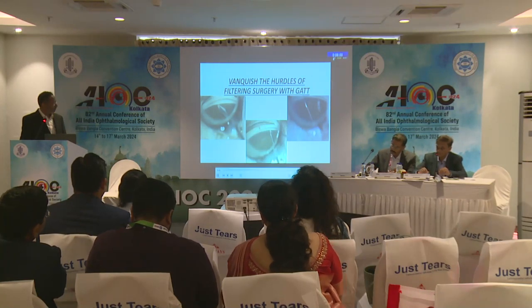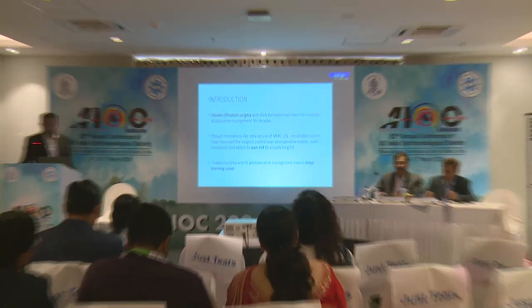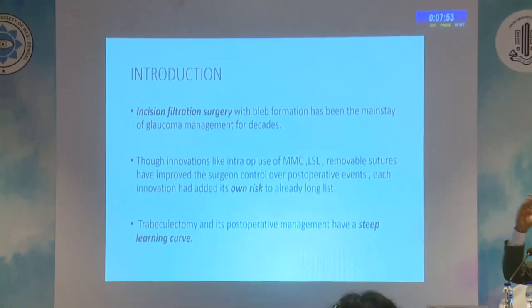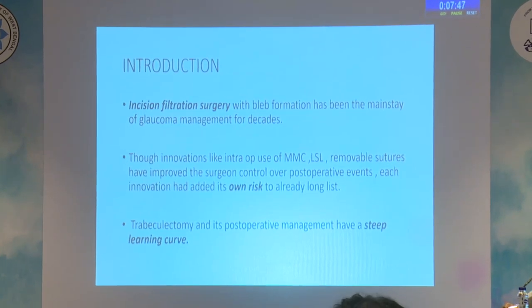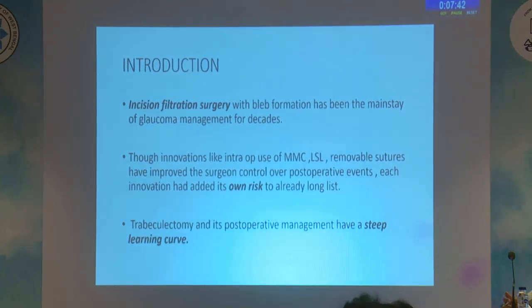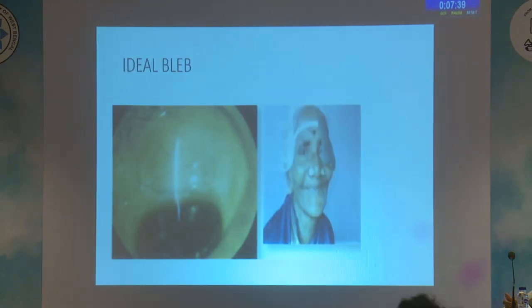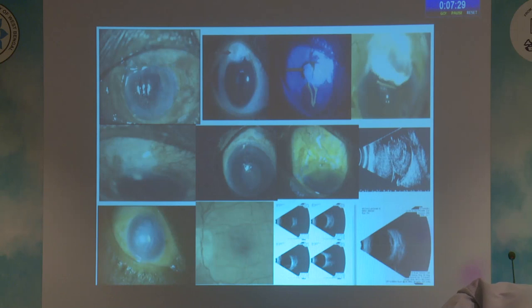Vanquish the hurdles of filtering surgery with gonioscopy-assisted transluminal trabeculotomy. Glaucoma is the leading cause of irreversible blindness worldwide. Trabeculectomy has been the mainstay of glaucoma management for decades. Despite improvements and innovations, trabeculectomy still comes with a heavy cost of complications. Though we expect and wish every surgical outcome with a low diffuse bleb and smiling face of the patient, unfortunately, we have to face several complications ranging from shallow anterior chamber, bleb bleed, blebitis, hypotony, and choroidal detachment.